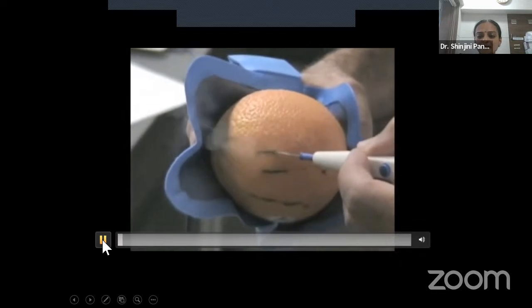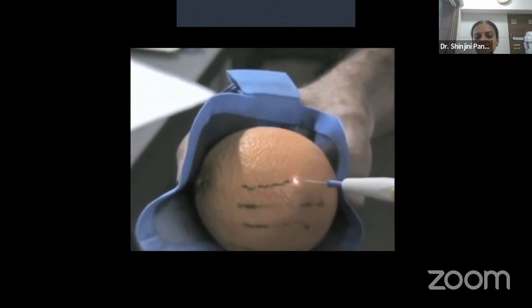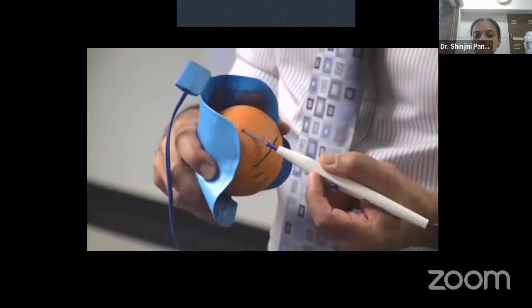Now, these are the same effects that we are showing on a video here. You can see that the surgeon's finger is on the yellow, and see the linear. This is vaporization. This was near touch and it comes as a clean cut. Now notice that in the next few seconds, his fingertip is on the blue, and see the sparking. You can see how Diwali mein Fulzhadi ke sparks sparkle out. So this is the sparking.